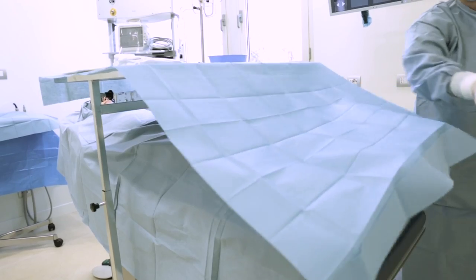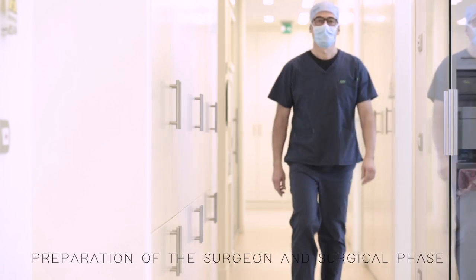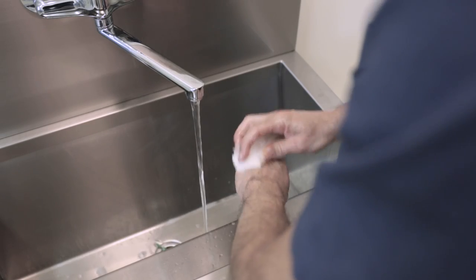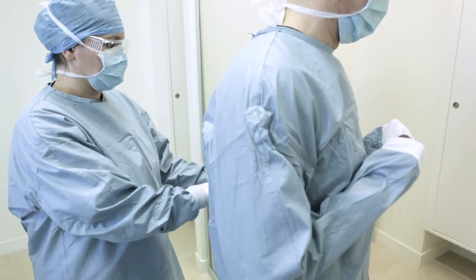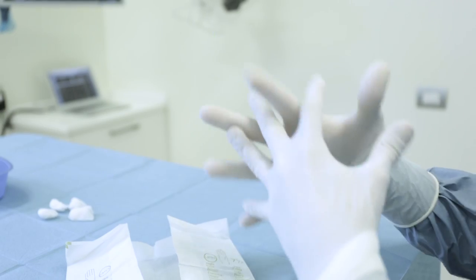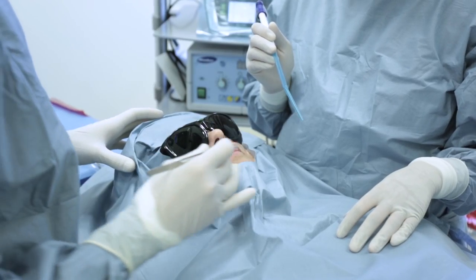Now the patient is isolated and the instrument table can be positioned. After washing the hands following the surgical procedure, the surgeon puts on the gown helped by the sterile assistant and wears the sterile gloves. Now everything is ready for the surgery.